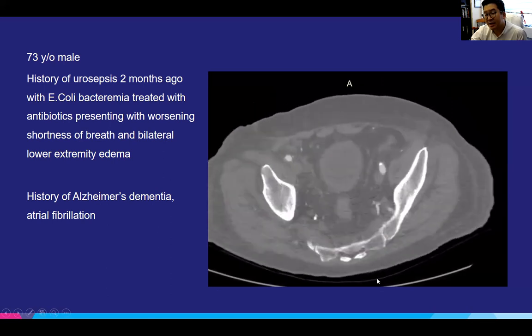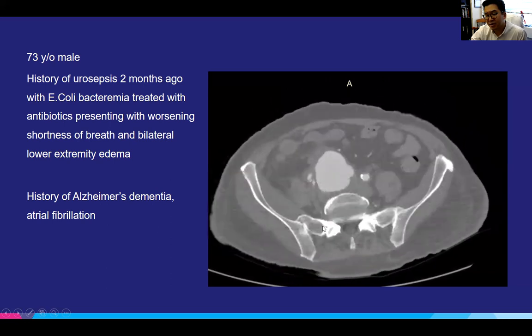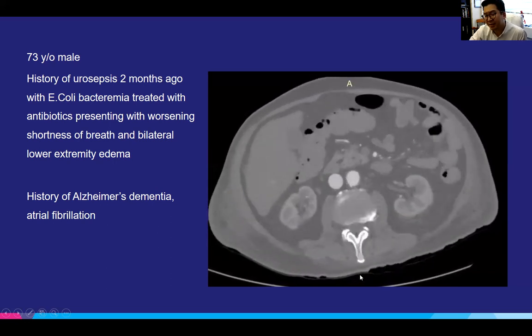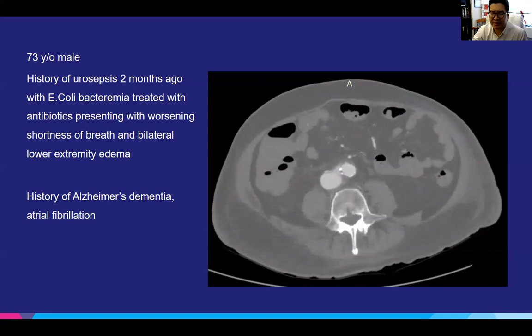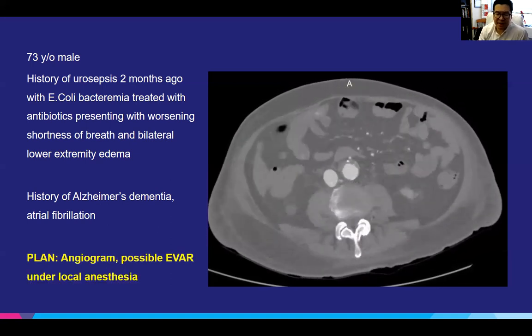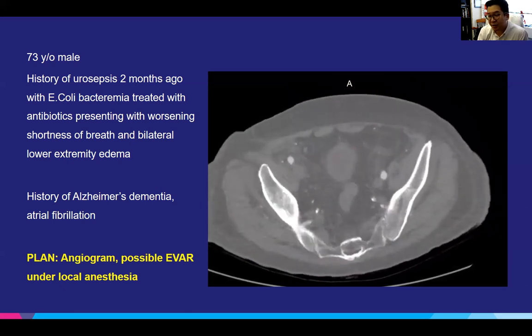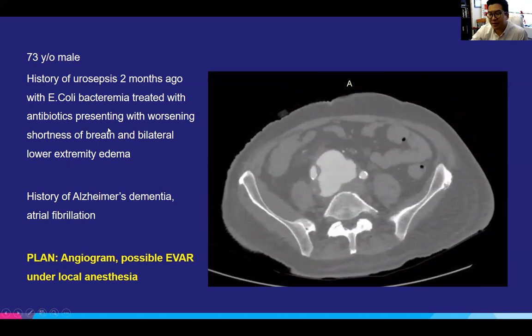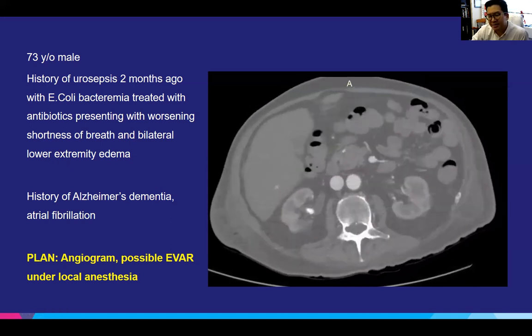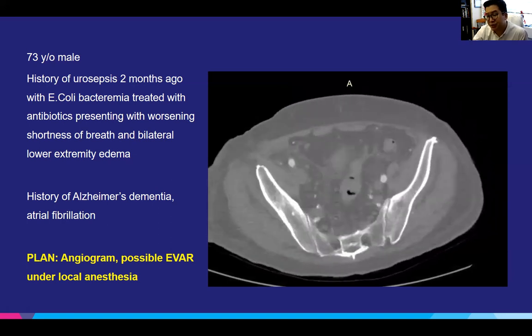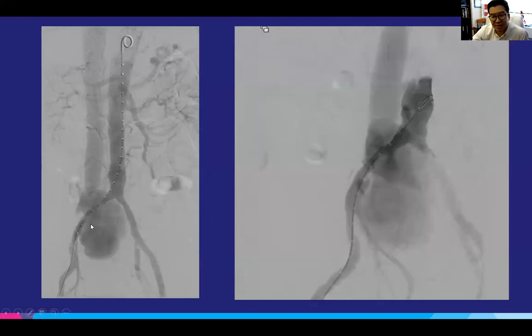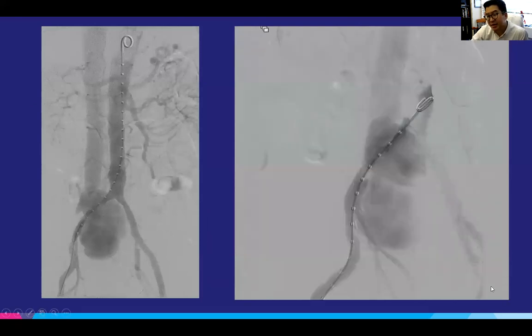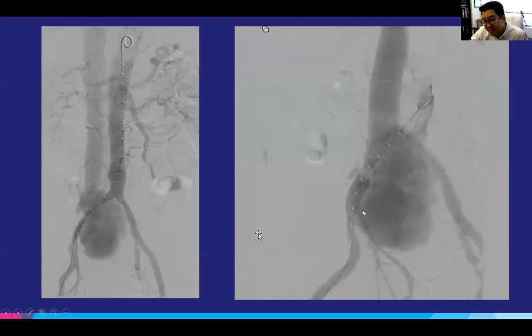This is the CAT scan we obtained at the time, and you can see early venous phase filling with contrast material. As you come down in the aorto-iliac segment, what appears to be a connection between the arterial and venous system — potentially a mycotic aneurysm that was forming an iliocaval fistula. There also appeared to be a second fistulous connection towards the bifurcation of the iliac vessels.